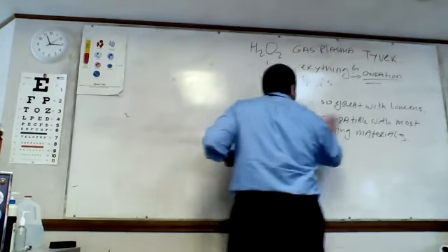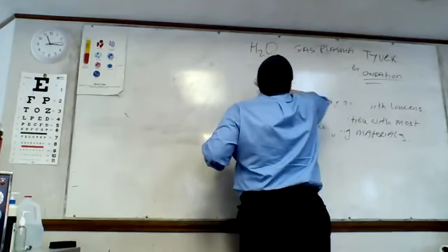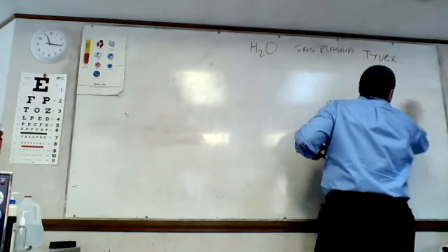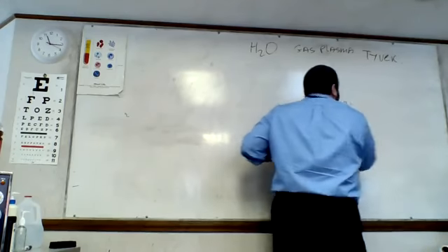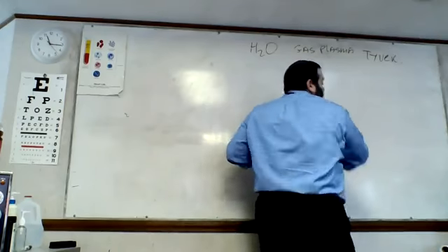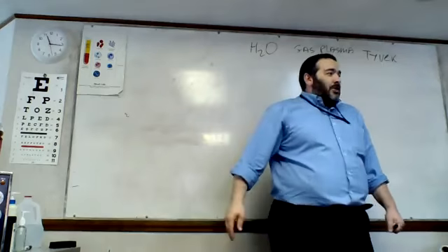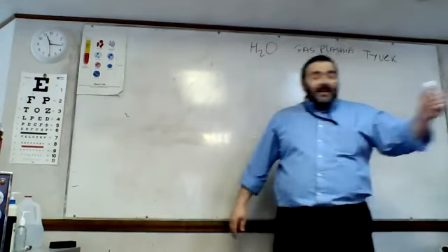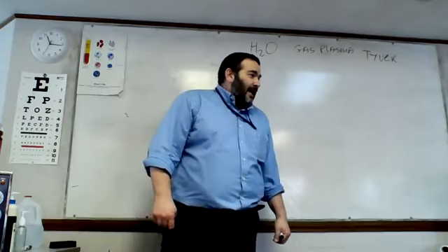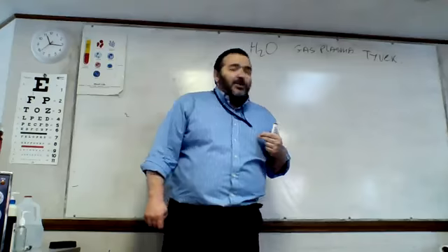All right? I have a question. Yeah. On these low temp sterilants, the chemical indicator doesn't work then, right? It does. It does, because I thought that was done by heat. No, it's exposure to sterilant. Okay, certain things on that chemical indicator tape, for example, it reacts to steam having both heat and moisture. Okay, and it changes color.